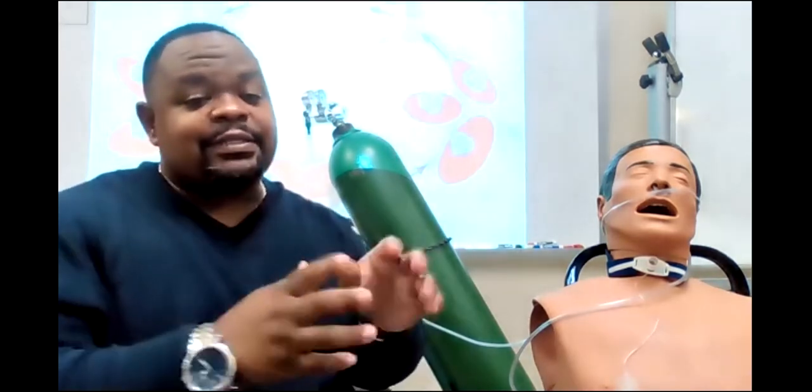Now, that is the nasal cannula. If he is up to about 5, 6 liters and he's still not oxygenating well, then I don't go up to 8, 9, 10 liters, okay? It's time for me to switch to the next low flow device, which is the next step in the ladder, okay? For low flow systems, it's a ladder. You start at the bottom with a nasal cannula. The next step will be a simple oxygen mask. Let me show you that.